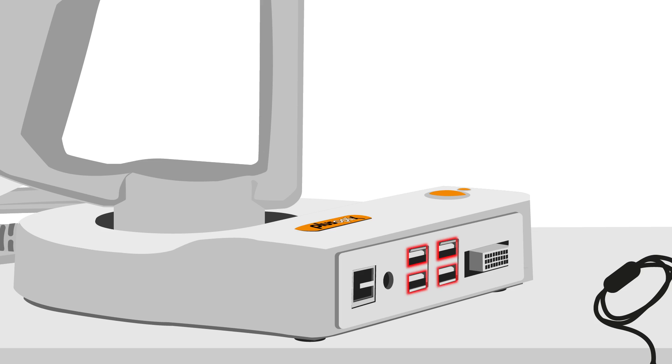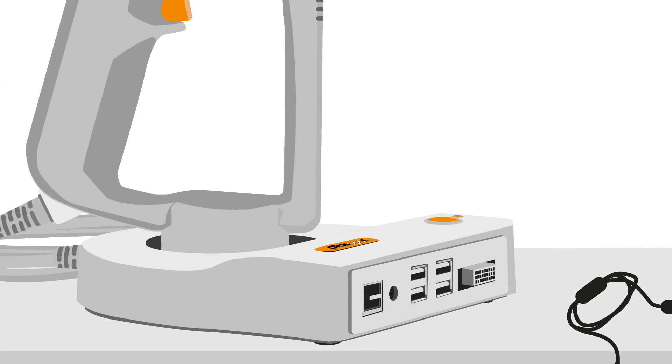In the middle, there are four standard USB ports followed by a DVI connector for optional connection of an external monitor. Located on the top right of the cradle is the orange power button.